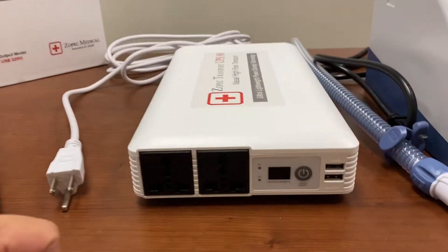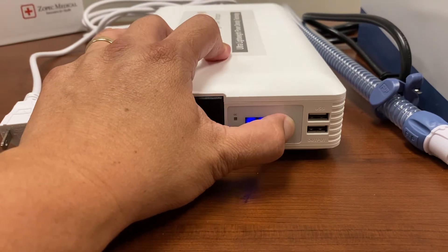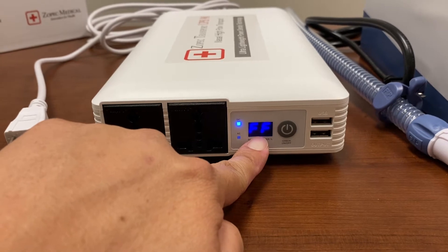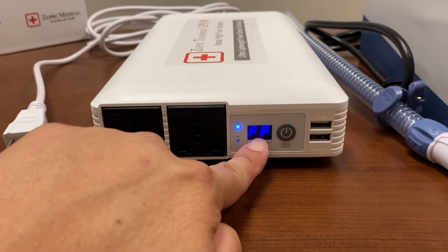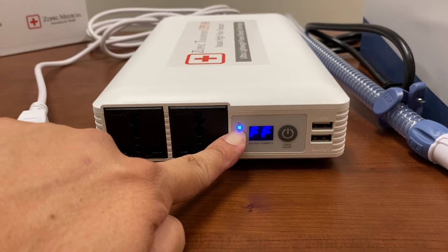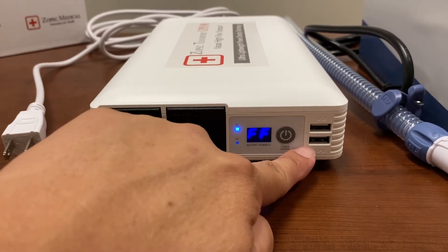To turn on the UPS battery, you just press and hold the power button, and you will see that the battery capacity indicator turns on. FF means full — 100% charged. You also see the blue indicator light; that is the DC indicator, which means the USB ports are on.